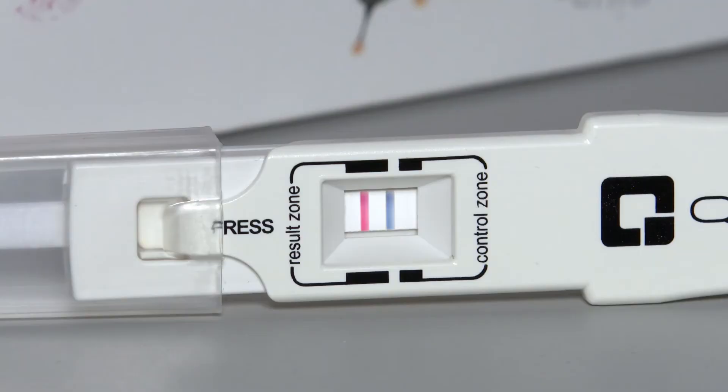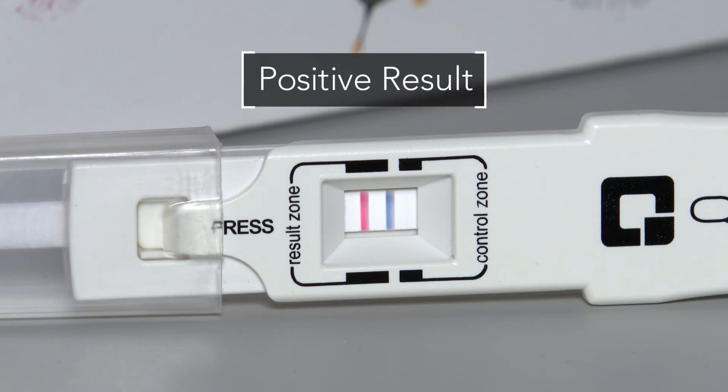The results of the test are indicated through two lines which appear in the result window: the control line and the result line. The control line appears as a blue line in the control zone. The control line indicates correct application and performance of the test and must appear for the test to be valid. The presence of both a blue line in the control zone and a red line in the result zone indicates a positive result.